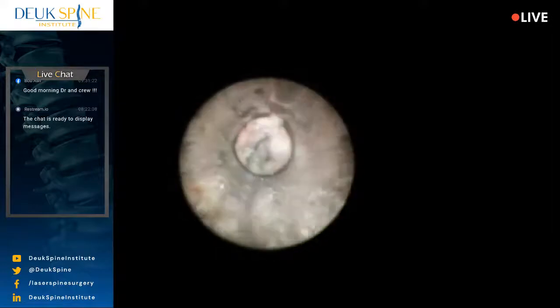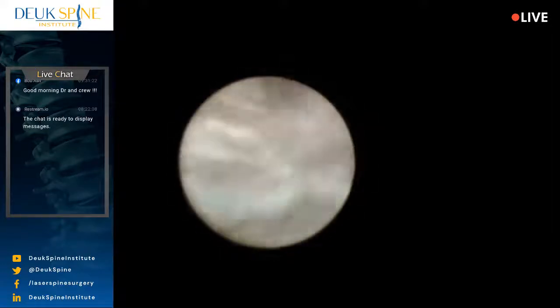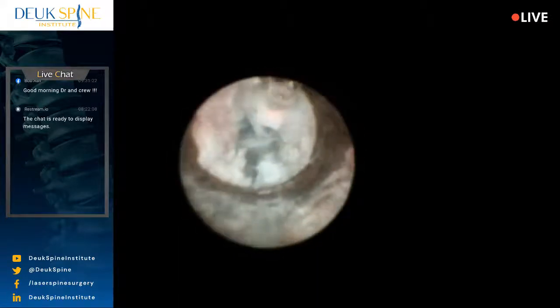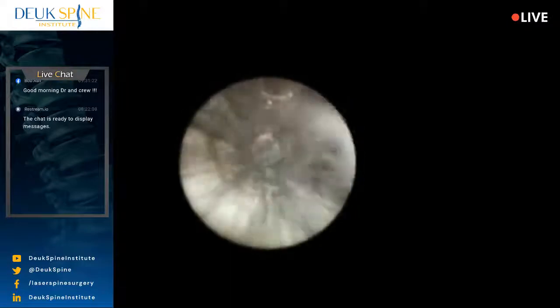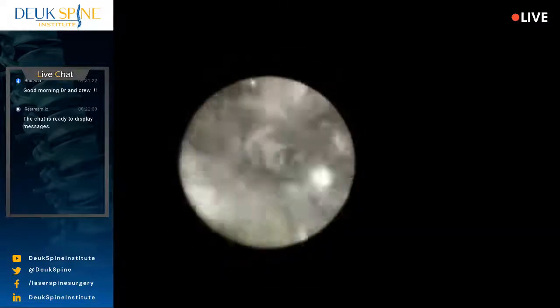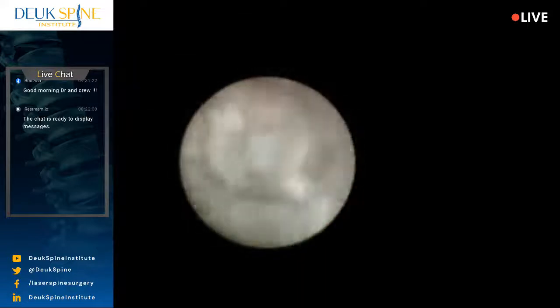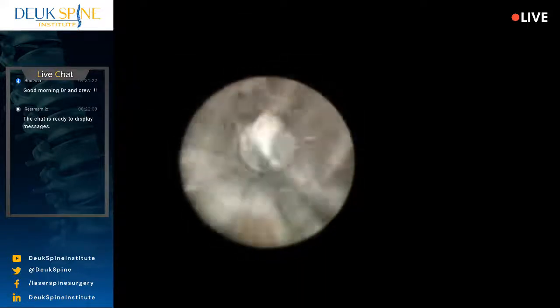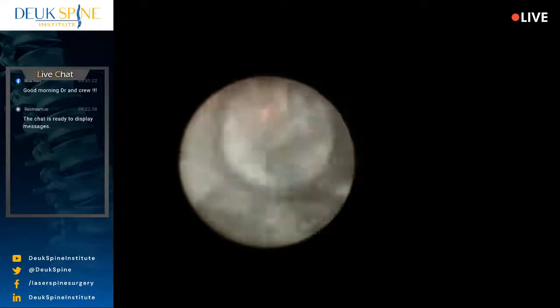Did you find the pumps yet, Luis? I checked yesterday. I have a couple. You have to get them in now. They're arthroscopic pumps. Yes, yeah. Just getting a lot of bubbles. I don't know why. Could be bubbles in the line. I don't know. I mean, there is cavitation, obviously.